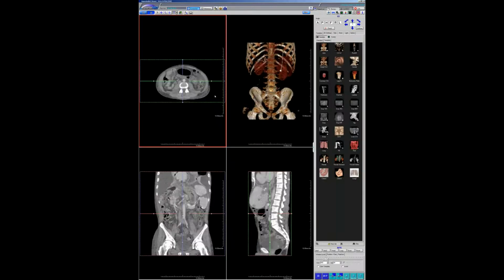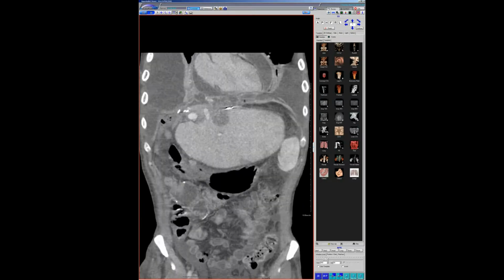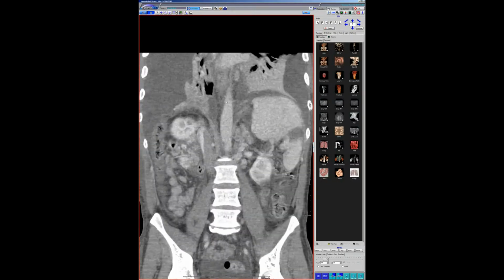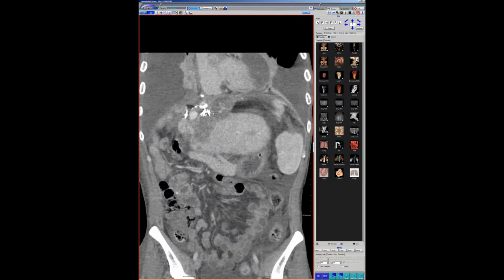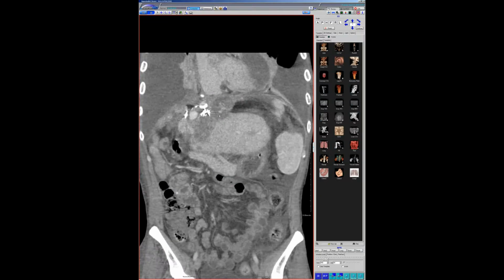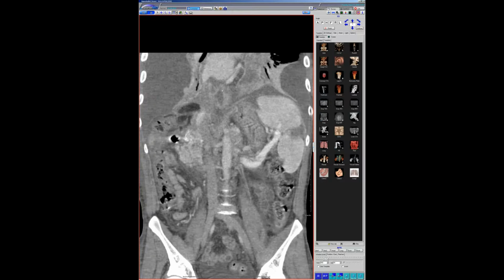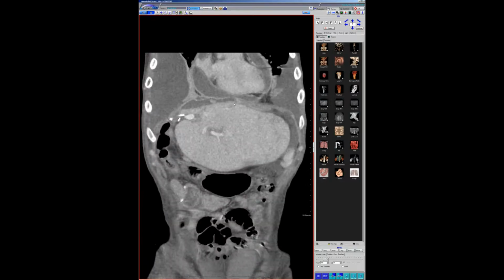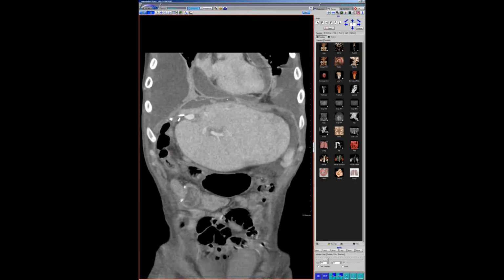But the interesting thing is, initially they kept thinking there was a fistula between the esophagus and the pericardium, because these are flora that usually live in the esophagus, but we didn't really see evidence of that. It's hard to tell, but there is this very strange fluid collection, which is contiguous with the biliary system, that's causing this large area of hepatic necrosis, and that is contiguous with the pericardium. You can see even there's this subhepatic abscess, and all of this in certain areas looks like it's communicating directly with the pericardium.